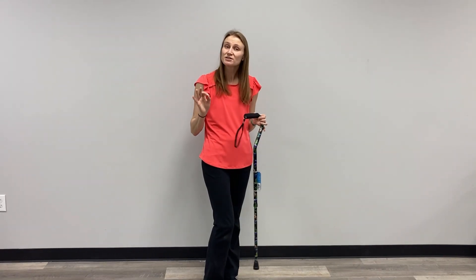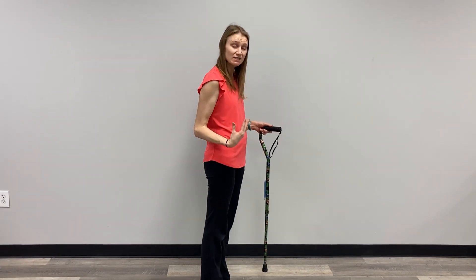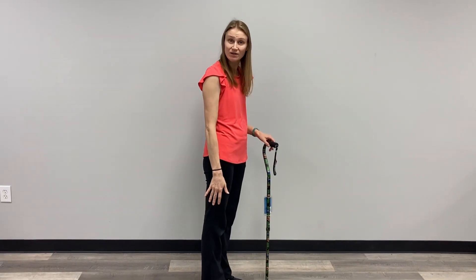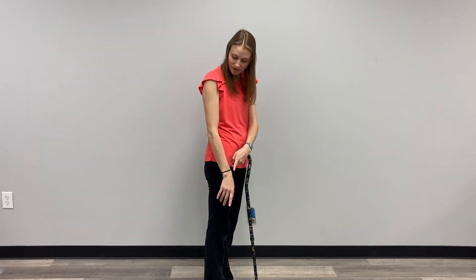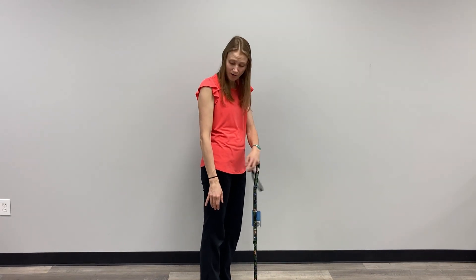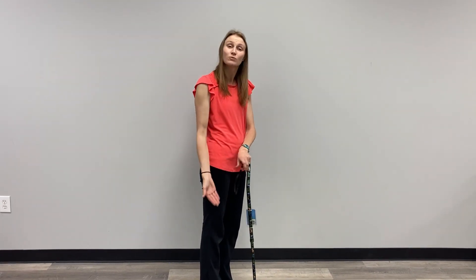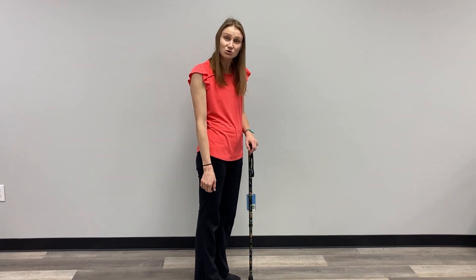The height we want to shoot for when adjusting our cane is exactly the same height we were going for when we talked about how to adjust your walker. If I am standing upright with my arms down at my side, I am looking for my wrist. I want the cane to be adjusted right at the spot where your watch would hang on your wrist if you were wearing one. This is where we want to start. We can make adjustments up or down from there as needed for comfort, but this is where we are going to shoot for to start.